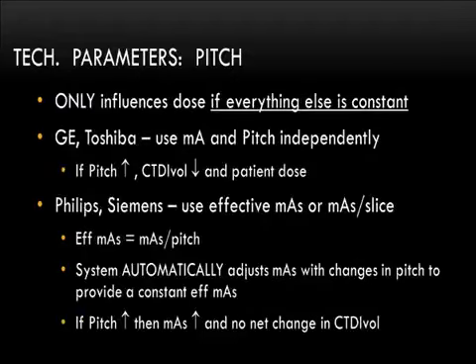Now, here's the thing that I really want you to remember. Pitch only influences dose if everything else is held constant. If all you do is change the pitch, but everything else is kept the same, then dose will be affected by pitch. What happens is sometimes these things happen outside of your view, and it's not clear from the user interface.